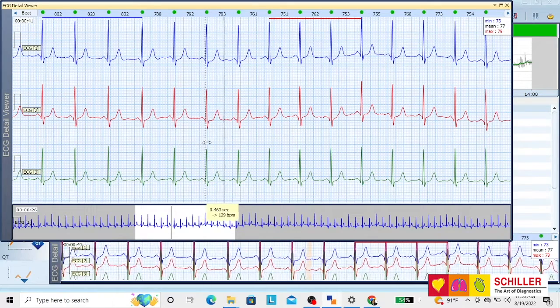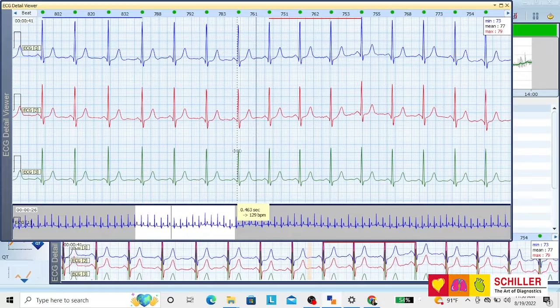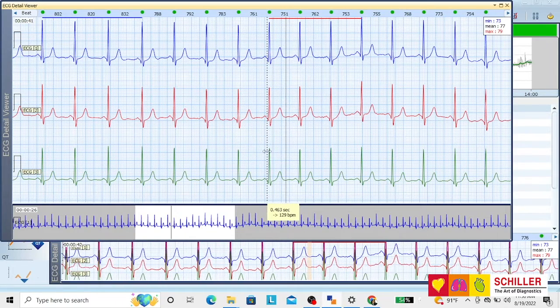You can compare by dragging the cursors from one beat to the other.